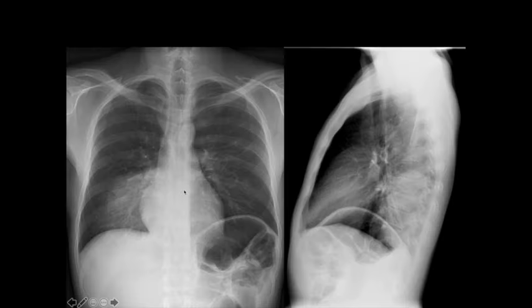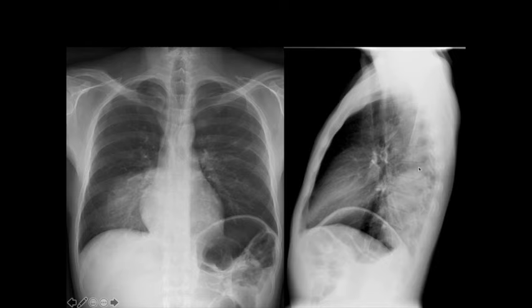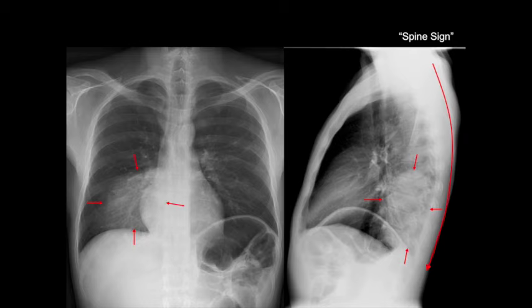Here's another case. Going through our approach — heart, mediastinum, comparing both sides — you notice this cloud-like fluffy opacity on the right. On the lateral, the retrosternal airspace is clear, retrocardiac airspace is clear. The spine sign — instead of getting darker as you go inferiorly, there is clearly something abnormal there. The spine sign is abnormal, suggesting airspace disease in the right lower lobe.